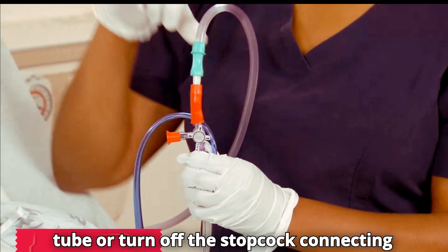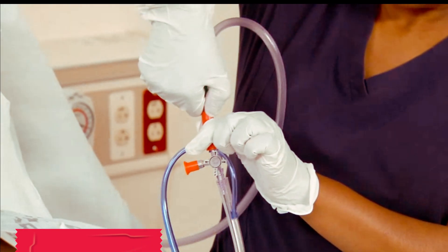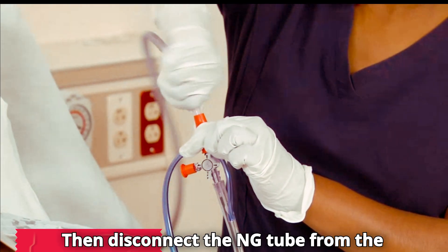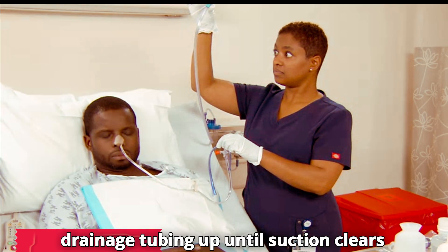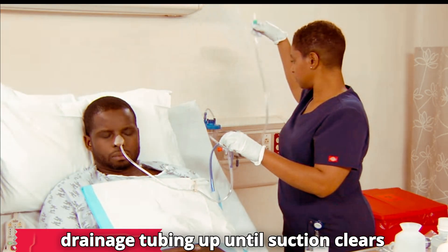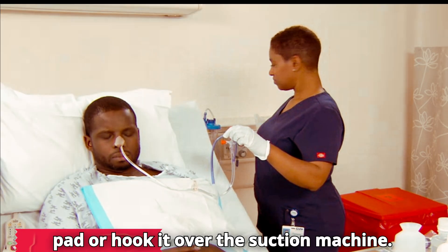Clamp the NG tube or turn off the stopcock connecting to the suction tubing. Then disconnect the NG tube from the suction tubing. Hold the drainage tubing up until suction clears it, then lay it on the linen saver pad or hook it over the suction machine.